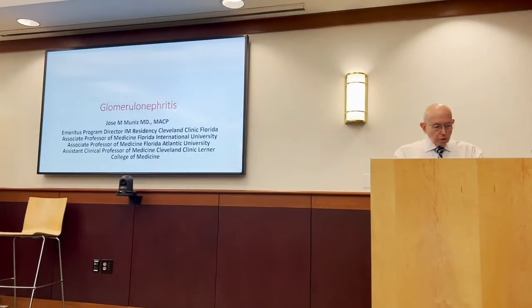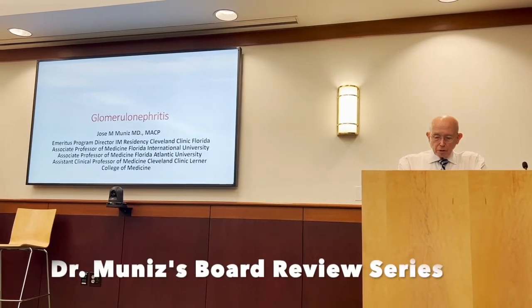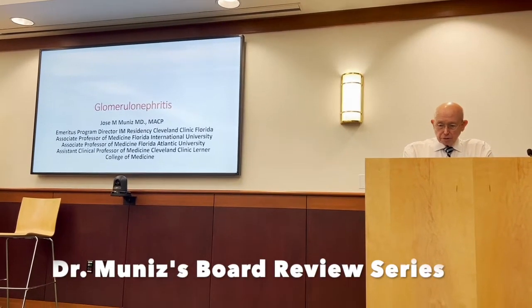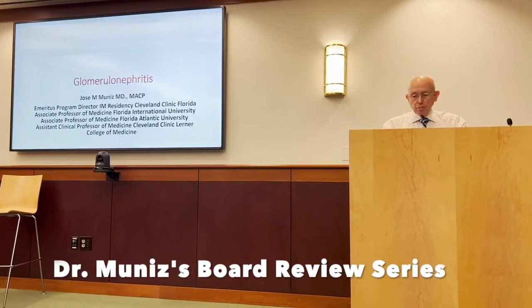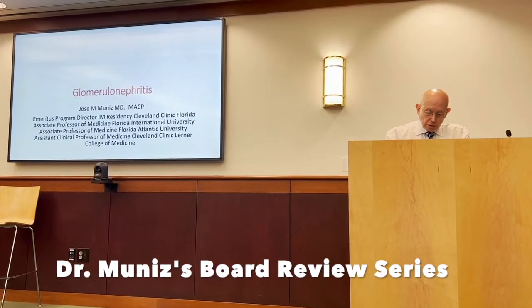Okay, so we're going to be discussing glomerulonephritis, but because of the extensive information here, most likely it will be divided into lectures. So the initial thing that we should know is to recognize a normal glomerulus. A few things that we need to pay attention to is the cellularity. You see the cellularity is fine. The Bowman space is very well preserved.